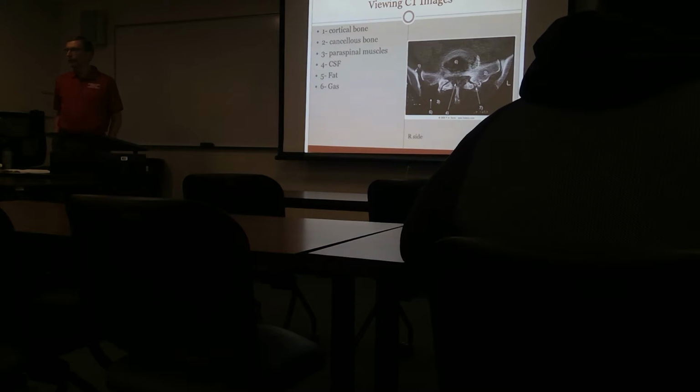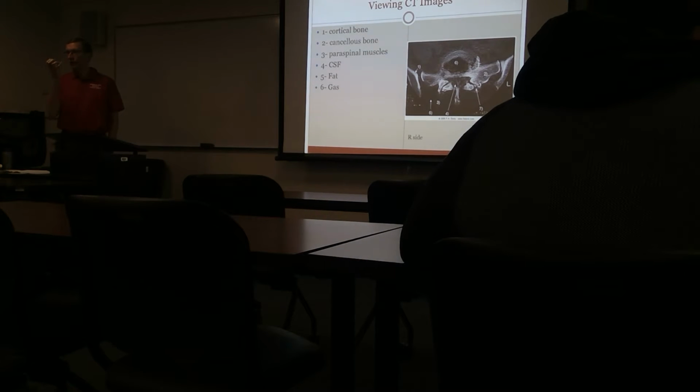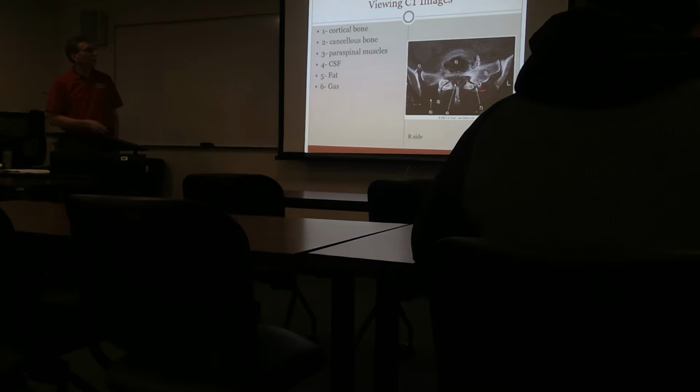We mentioned this in the lumbar spine. What phenomenon was that called if you have nitrogen gas in a vertebra? We said we're going to talk about it in imaging. It's called a vacuum phenomenon. The vertebrae degenerate. They generate gas. Okay, and what articulation is highlighted by 7 here? What does that look like?